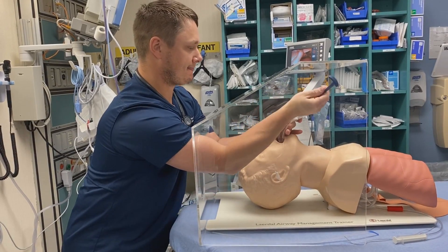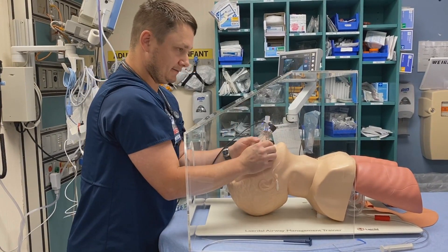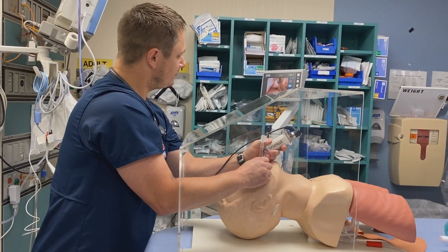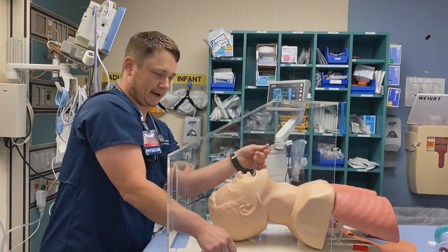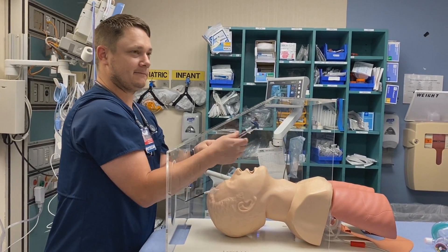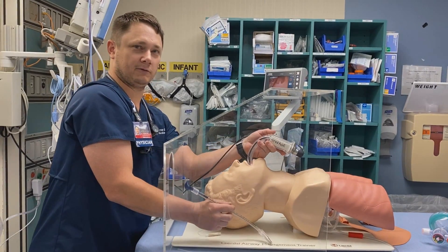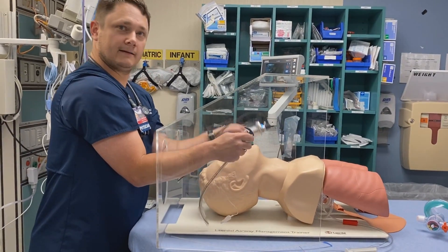There is a little bit of bouncing — touching of that window. You could hear it hitting the plexiglass. I still think, though, for safety and ease of operation, it improved my comfort. I would say it probably reduced the anxiety that many people may describe when dealing with these complex COVID potential intubations and the concern for exposure.